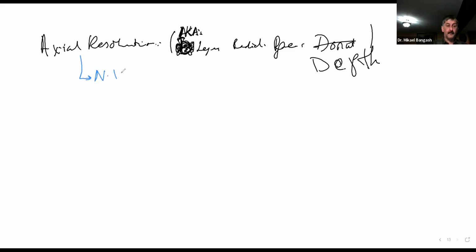What was the numerical value of your axial resolution? Spatial pulse length divided by 2. Good job.